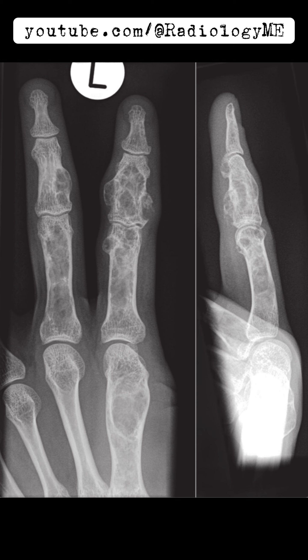The expansion of these lesions is quite typical for enchondromas. Enchondromas are the most common benign lesions that can occur in any bone, especially in the small bones of the hands and feet, like in this case. They often contain chondroid matrix, although in the phalanges, they can sometimes be entirely lucent, which we seem to be seeing here.